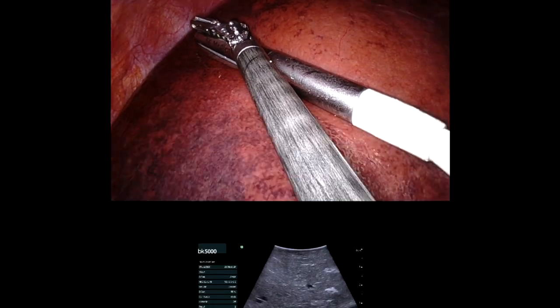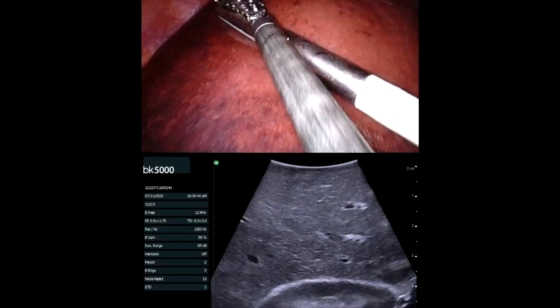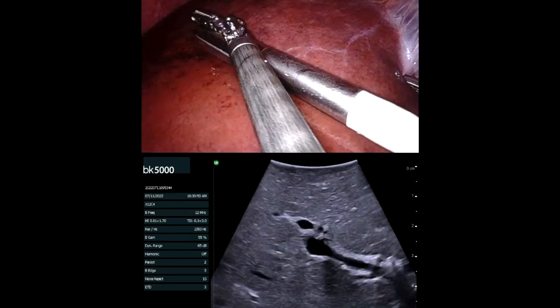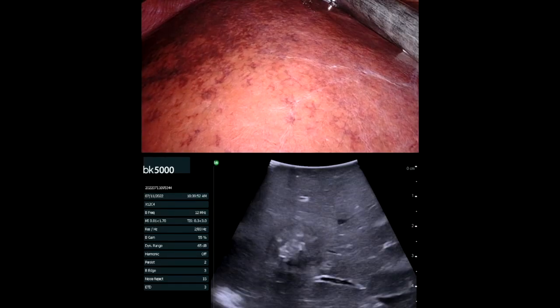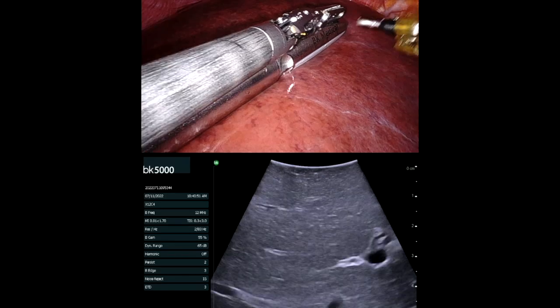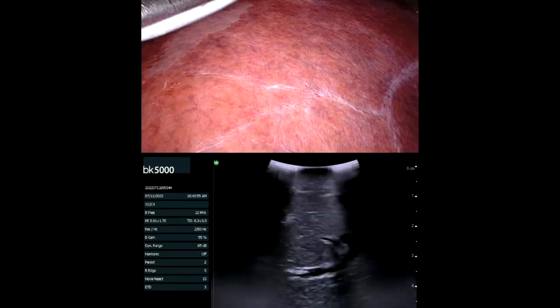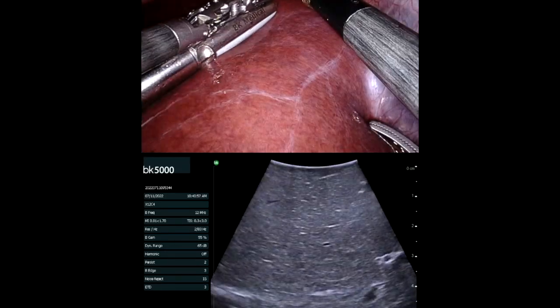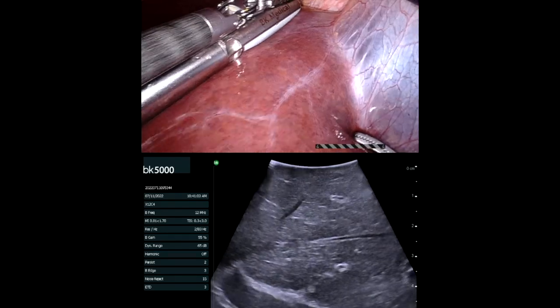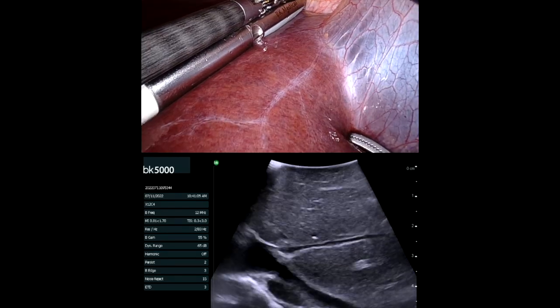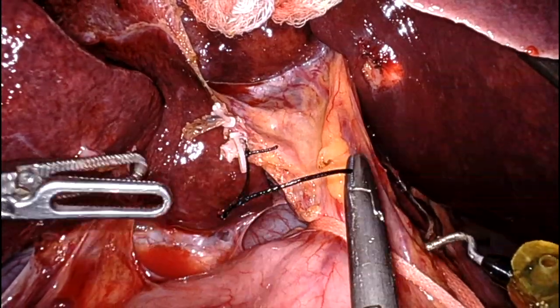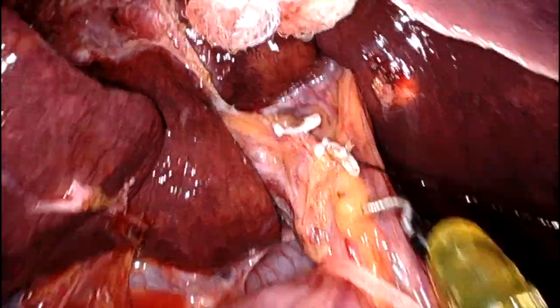Liver ultrasound, looking for the lesions. There's that prominent one in segment eight — it was two centimeters away from the middle hepatic vein, so I really needed to stay close to the middle hepatic vein in the upper part of the dissection. You can see the course of the middle hepatic vein. I marked it on the surface of the liver under ultrasound guidance.